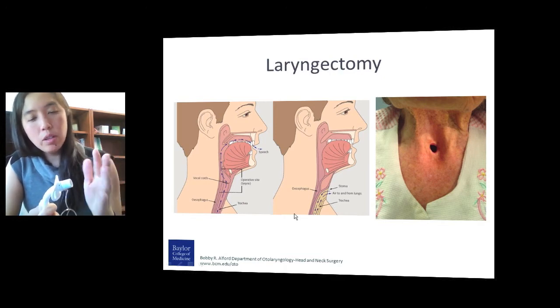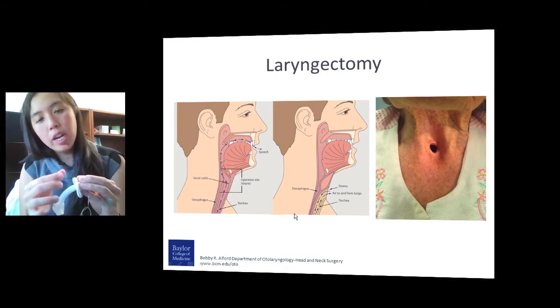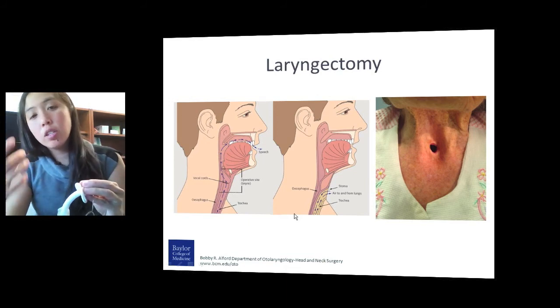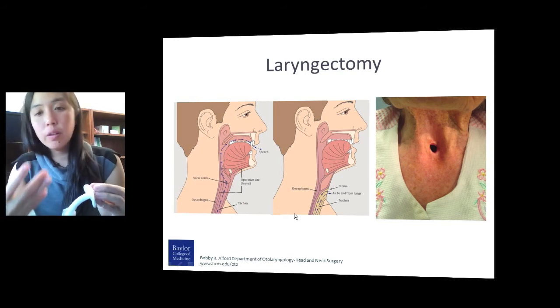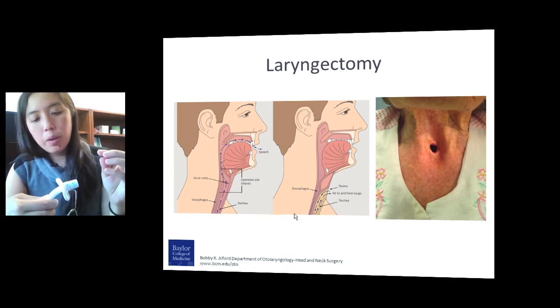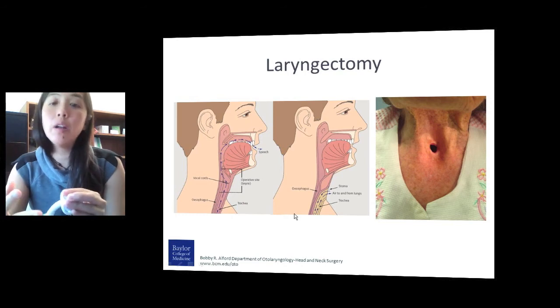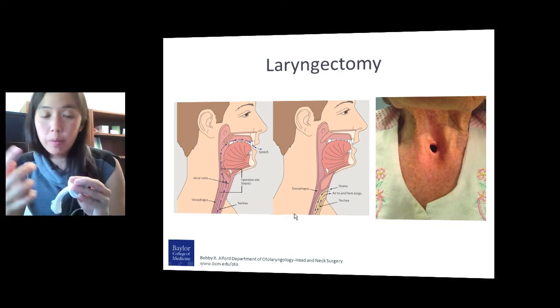When they exhale, the valve will close, so the air then passes around the trach, back up through the larynx, and they can talk with their own larynx, so it sounds like their voice, with a speaking valve. In addition, with a cap, you can just put a cap over the trach, and then they're breathing through their nose and mouth like you and I, and they're talking with their larynx as well.